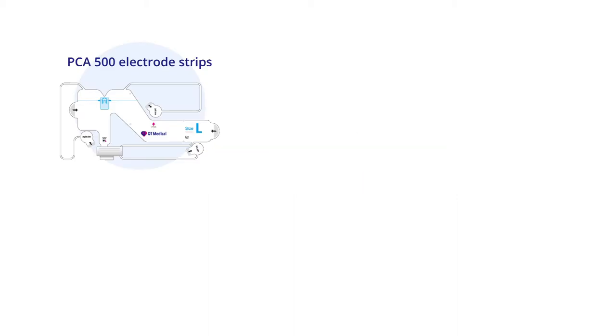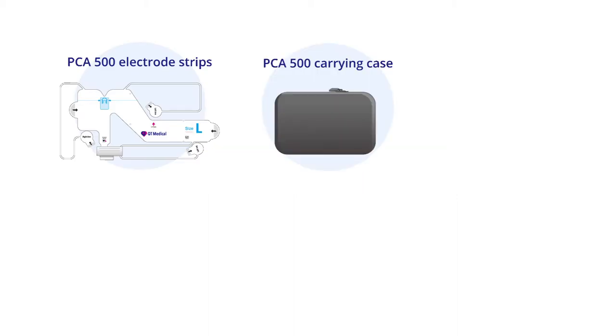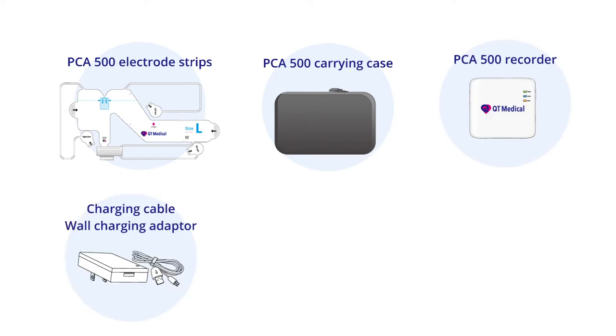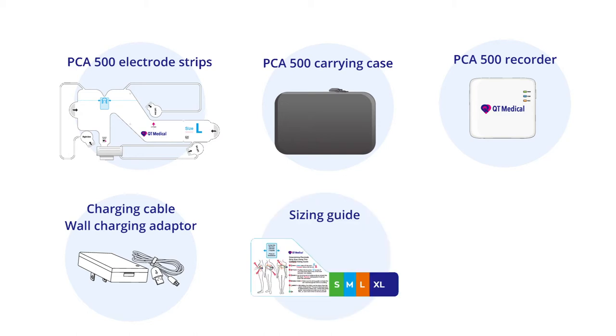You will find PCA 500 electrode strips, PCA 500 carrying case, PCA 500 recorder, charging cable, wall charging adapter, sizing guide, and quick guide.